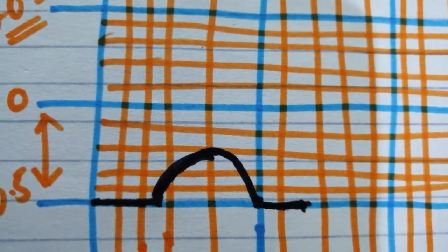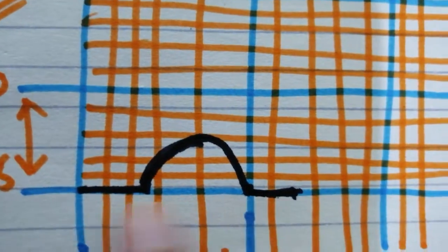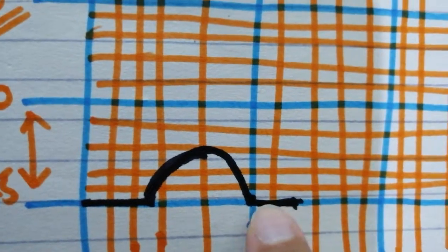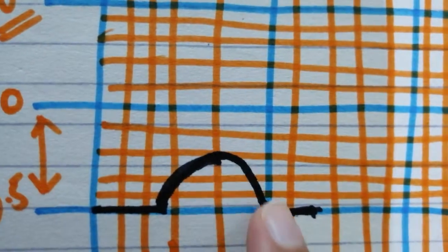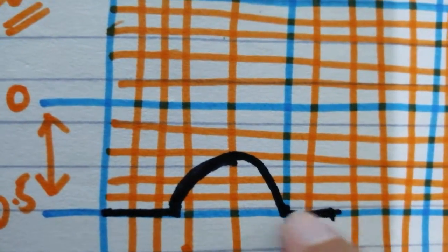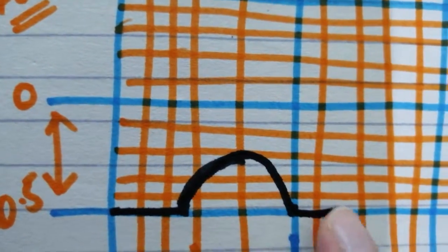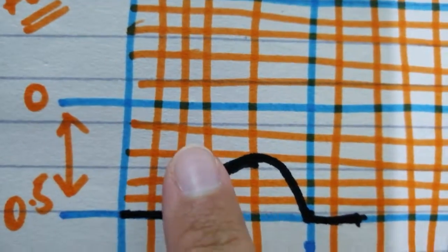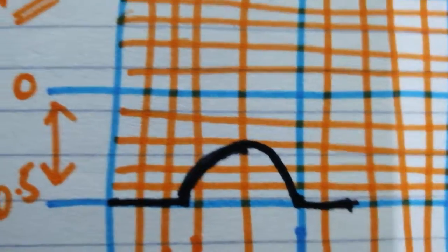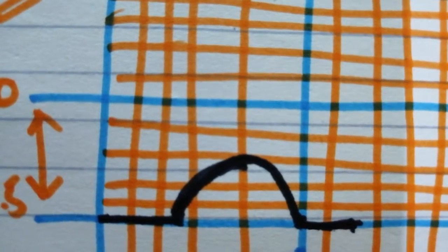So all of this whole thing represents the amount of time taken when the impulse is being transmitted from the atria to the ventricles and has not yet reached the ventricle. So all of this is the PR interval. This small part over here is the AV nodal delay, right? And this is the time where the atria are depolarizing but have not fully depolarized. At this point, the atria have fully depolarized. So this was the P wave, this was the PR segment, and all of this including the wave and the isoelectric line is the PR interval.